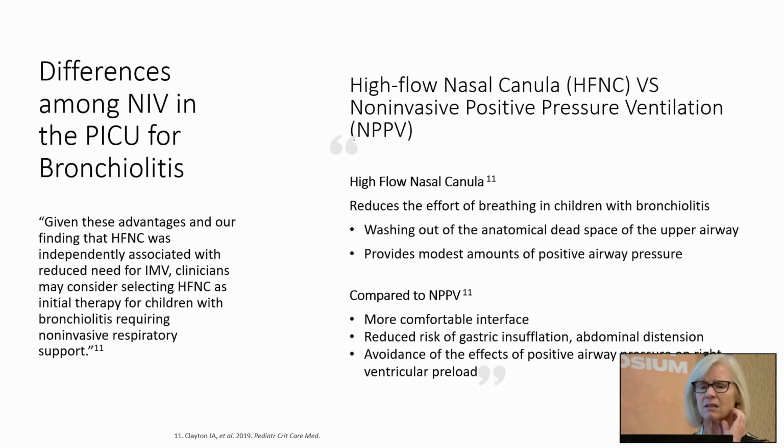And in the discussion section of this study, what they talked about was why this happened. So why did the kids who were on high flow get intubated less frequently? Well, we know we're learning more and more about high flow, which is really great. I think that if any of you guys practiced through COVID, you probably used a lot of high flow therapy on your patients because it washes out the CO2. Similar to non-invasive ventilation, it's going to wash out that CO2 in the upper airways. High flow can generate a certain level of positive pressure in the lungs. We're not quite sure how much, but it does create some, so it does help in the work of breathing.